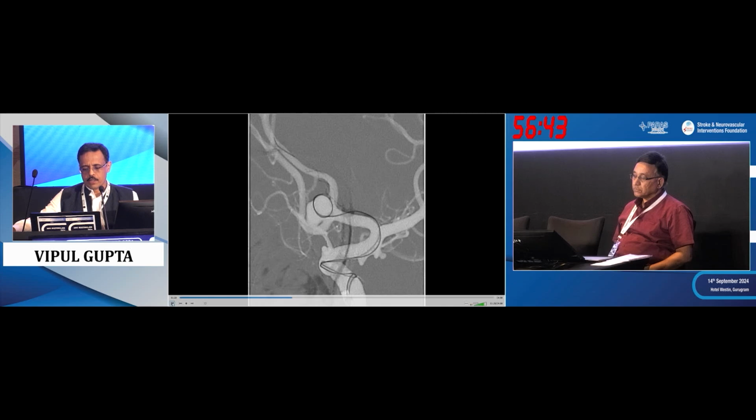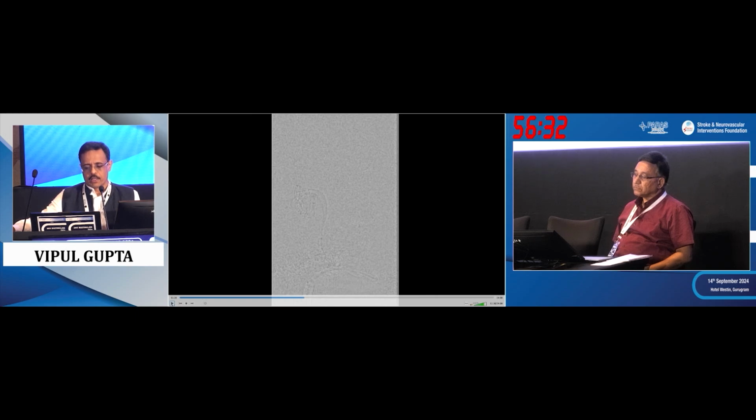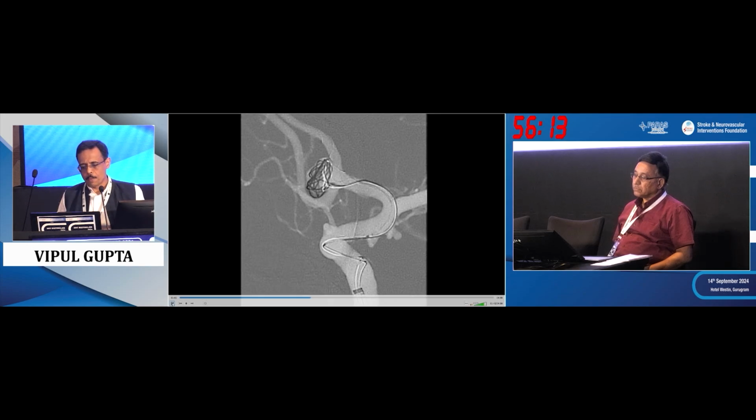And when we come here, this is where we push both the stent microcatheter to expand the stent a lot, as you can see here. And so we have pushed the micro, and suddenly you can see the stent overexpanded there. And that is very important to really what we call a shelving technique. But when you are doing this, your guiding should be very stable. So your junior or your other hand should be on the guiding, pushing it forward. That's the only way you can build up force to overexpand the stent in that area, so that we can try to cover most of the neck by a single device.